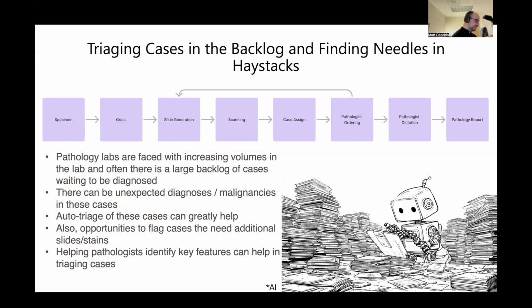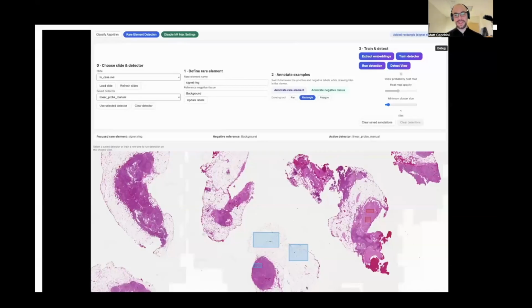And that's where I think a lot of the initial things we should think of for these AI agents and algorithms is really in this initial QA aspect of it. It's not really from a diagnostic perspective, but just helping us automate some of these other things that take a lot of time. And so this is what the program looks like.